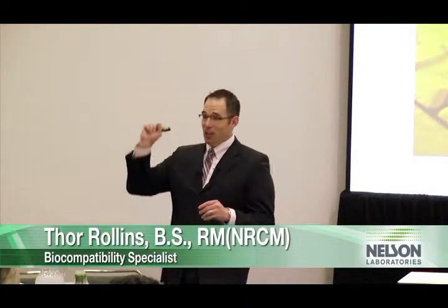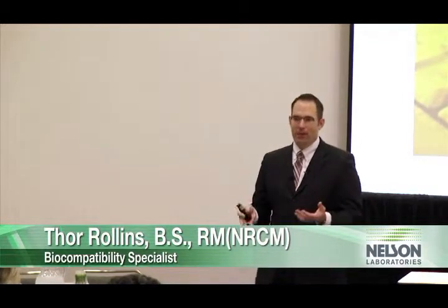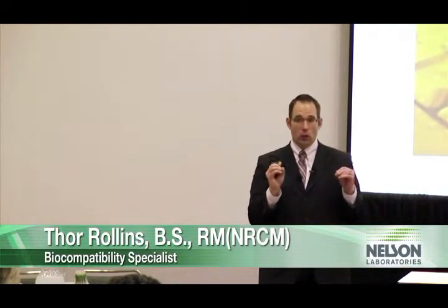So if the predicate is really high, then you might be fine. You might get a question of, wow, why is your predicate so high? But as long as you can show your predicate has a history of good use on the market with no complaints, then you can show that comparison and have a justification. But if you are much higher than your predicate device, then what we'll have to do is an investigation on how to explain the result and the test.